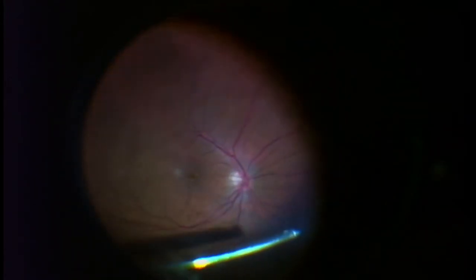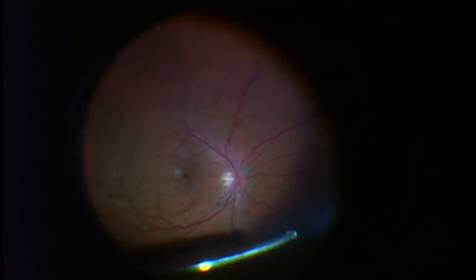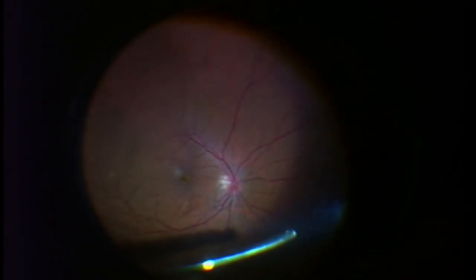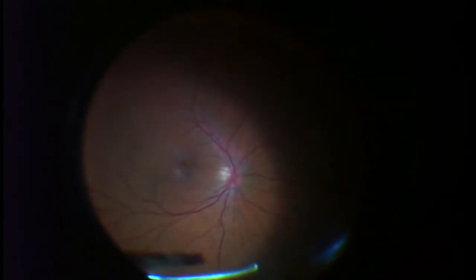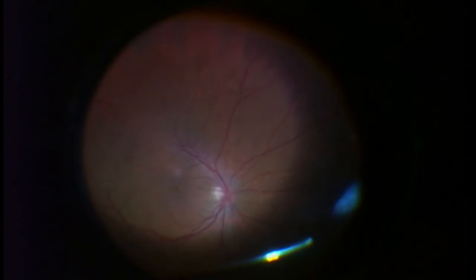The vitrectomy starts and you can see the shadow of the Weiss ring and the floaters jiggling on the retina. You can also see some fluid densities as the artificial saline starts to mix in with the vitreous fluid. We see this from time to time — it's almost as if you're pouring concentrated sugar water into a glass of water; you can actually see the sugar water mixing in.